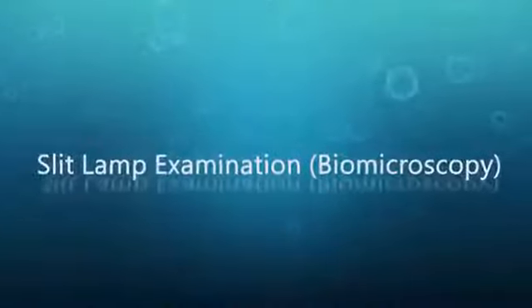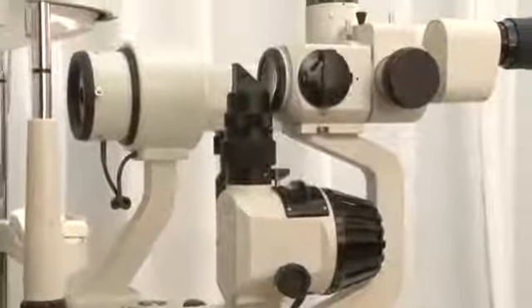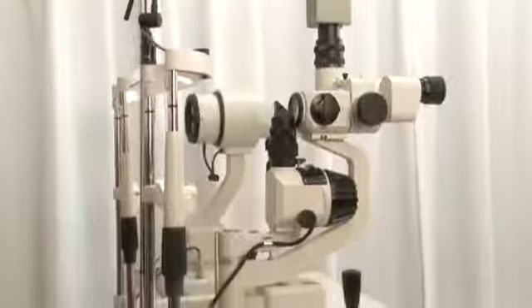Slit lamp examination, biomicroscopy. The slit lamp, also known as the biomicroscope, is a product of optical, engineering and electronic technology.